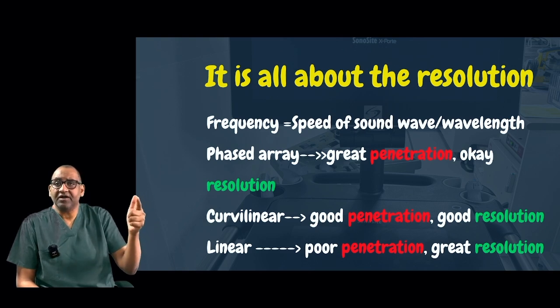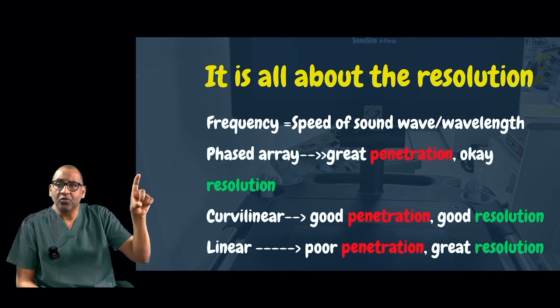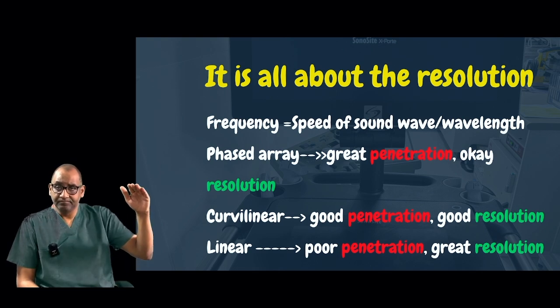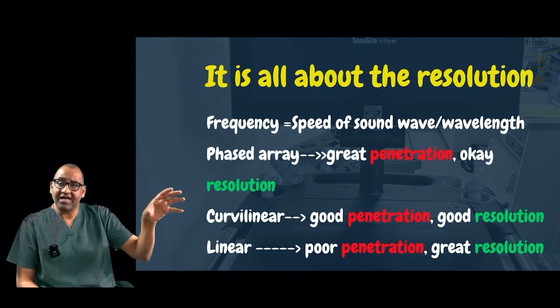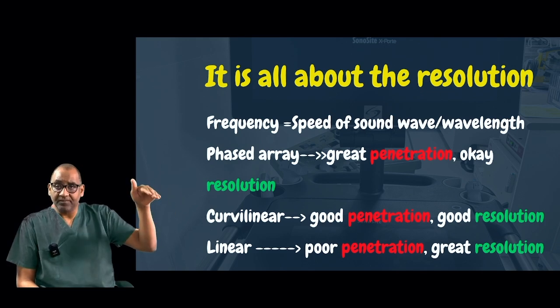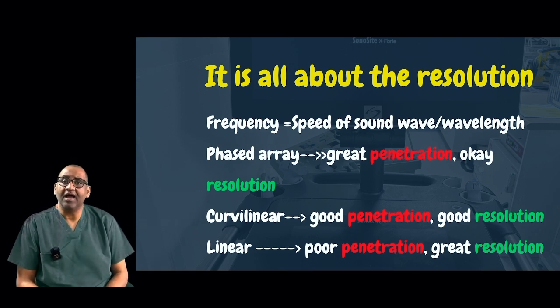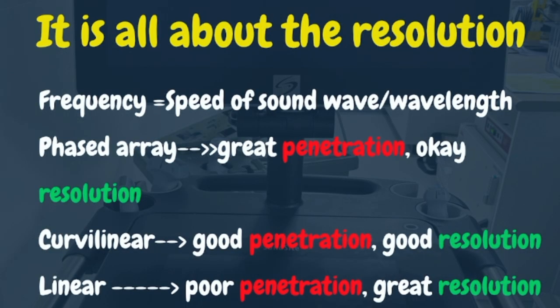So, for example, if you are aiming to look into a vein or an artery, then you will use the high frequency probe, which is for shallower or superficial structures. This is different from the curvilinear, which has the property of deep penetration with less quality of resolution.